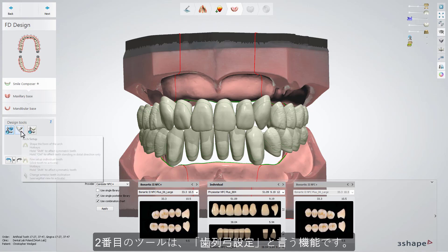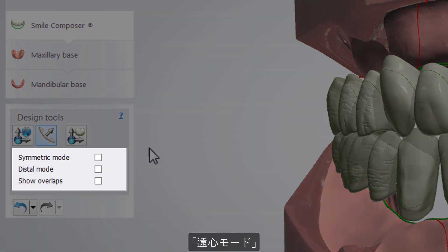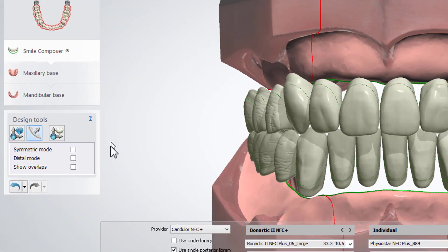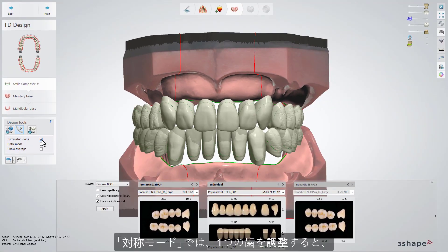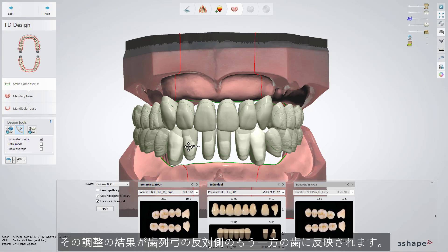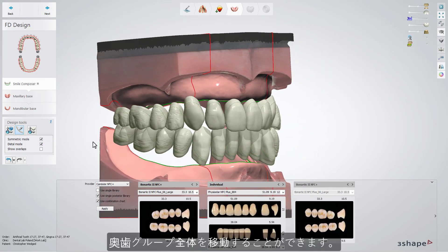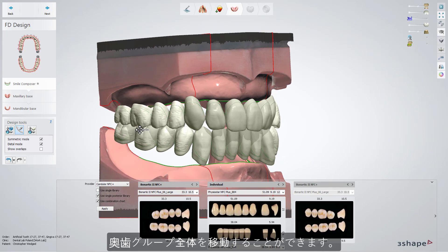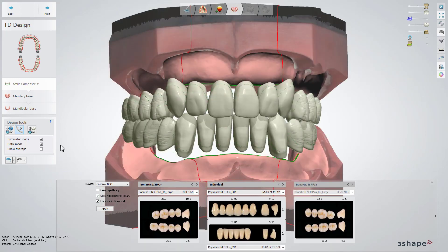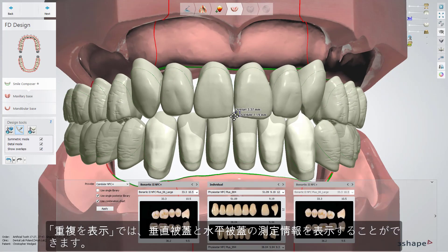Our second tool is Arch Setup. Under this option, you've got Symmetric Mode, Distal Mode, and Show Overlaps. From the additional options, you can work with Symmetric Mode, where adjusting one tooth will reflect on the other one from the opposite side of the arch. You can switch to Distal Mode and move the whole group of posterior teeth altogether. The Show Overlaps option will give you information about what kind of overbite or overjet you have.